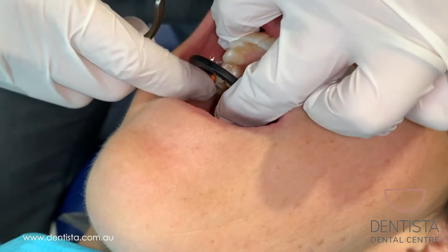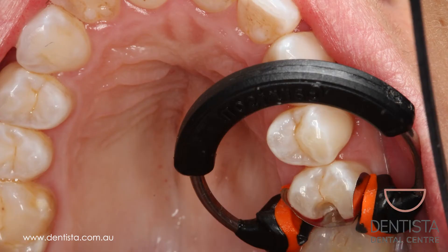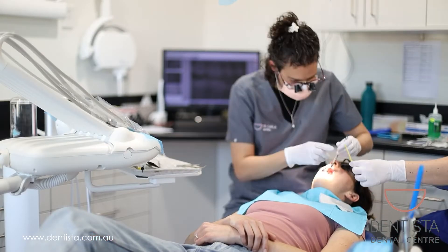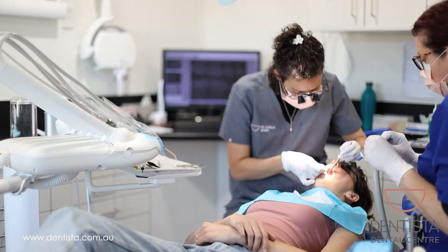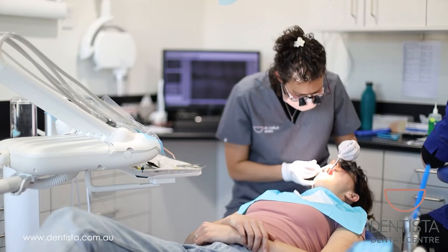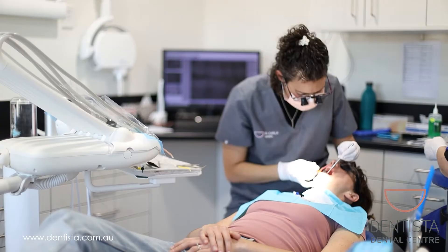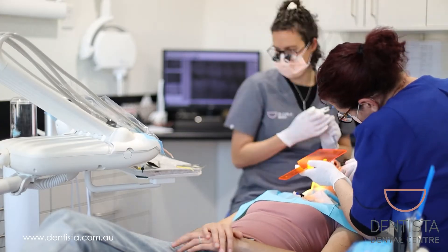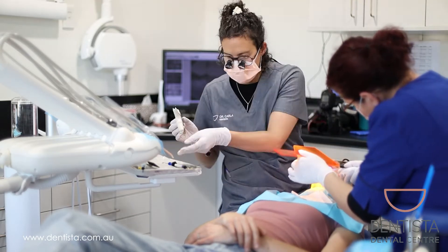Once we've finished putting the filling material in, all the matrix comes out. Now you can see me bonding in the white filling to Erin's tooth. The filling material is called resin composite and it goes in soft so that it can adapt to the exact shape of Erin's cavity and so there are no gaps anywhere.